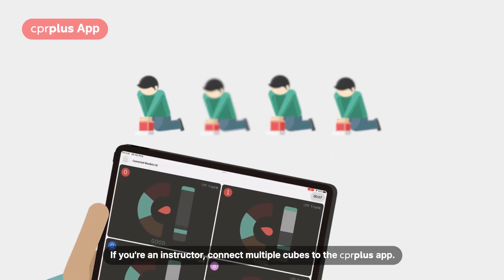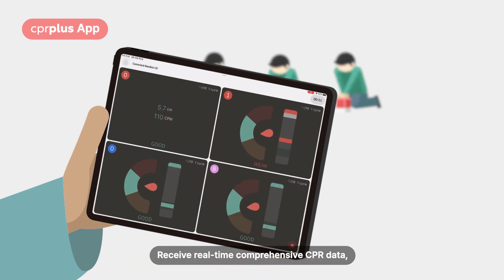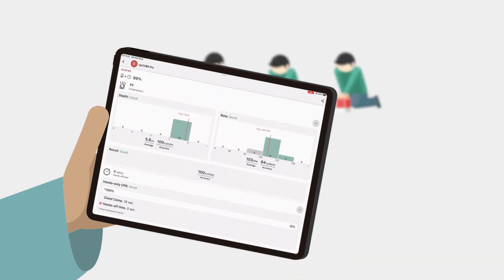If you're an instructor, connect multiple cubes to the CPR Plus app to measure CPR in real time. At the end of the session, you can provide feedback to students by reviewing the scored results.